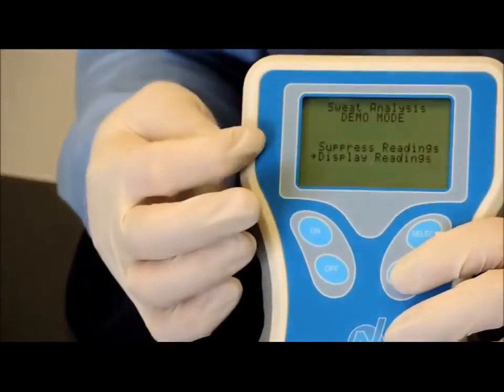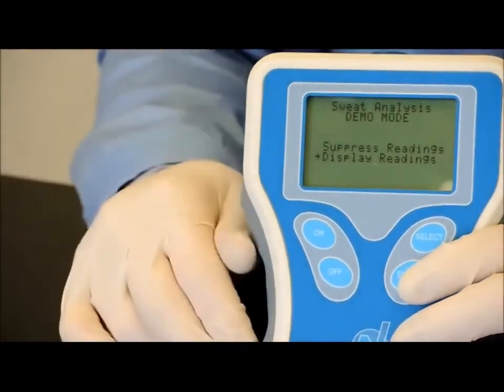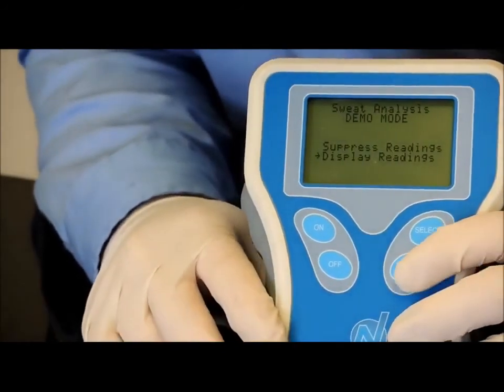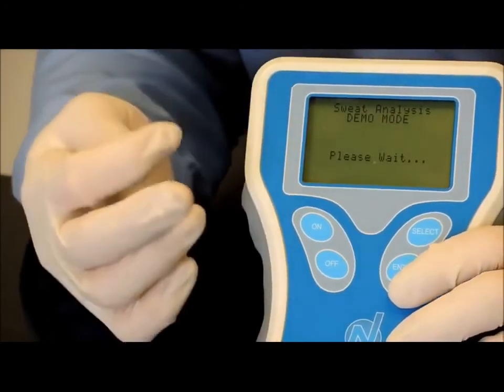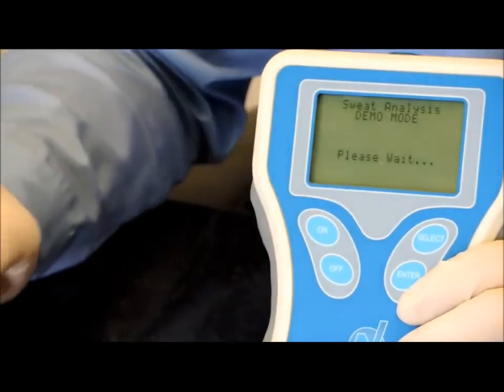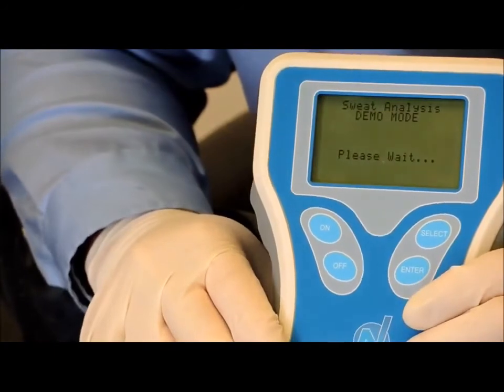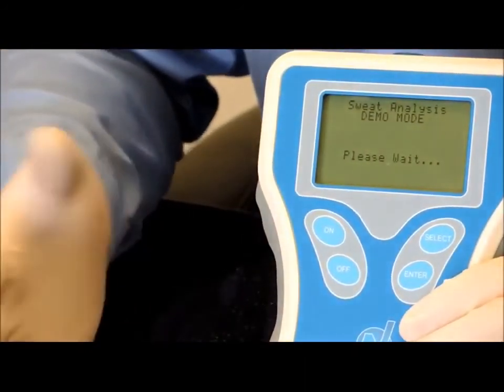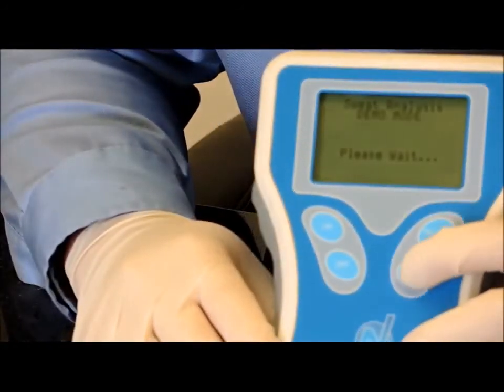And we have the choice to suppress or display the readings. So again, this could be useful if you want to really see the difference between suppress and display the readings. In this case, I'll select display readings again. So now it says please wait, just like I showed you before with the patient, it's waiting for sweat to come into the sensor cell. If I let this go, it would take a few minutes like we normally would expect, or I can expedite it by pressing enter.